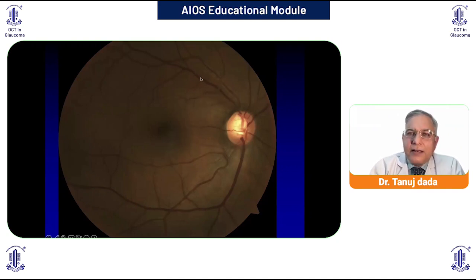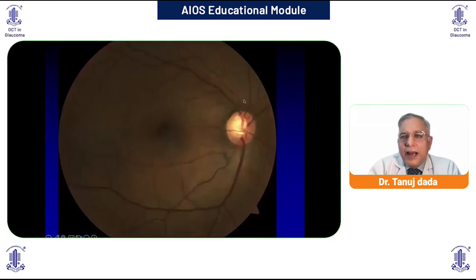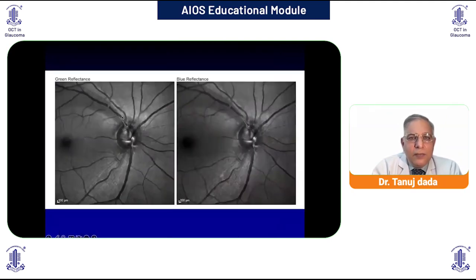So it's only with practice that you will be able to identify this RNFL defect, but there is definitely a notching of the neuroretinal rim which is occurring. So then this is the multicolor. Now you can see immediately, there was a slight difficulty in diagnosing the RNFL defect, but on the multicolor image, a very nicely demarcated superior RNFL defect has become visible. So clinically now there's an alarm bell. There is a superior RNFL defect visible on the multicolor photograph of the OCT.